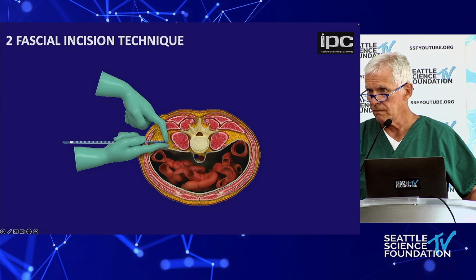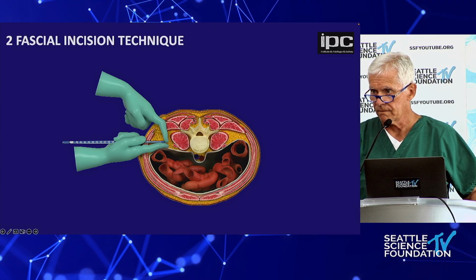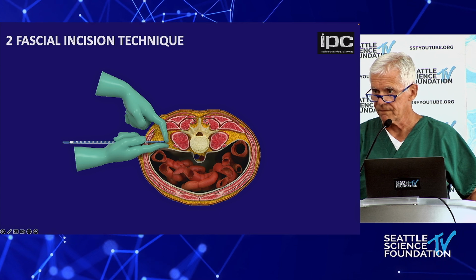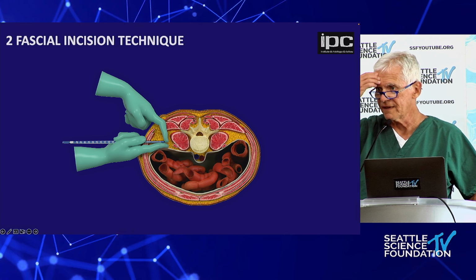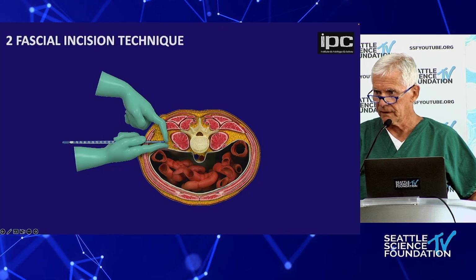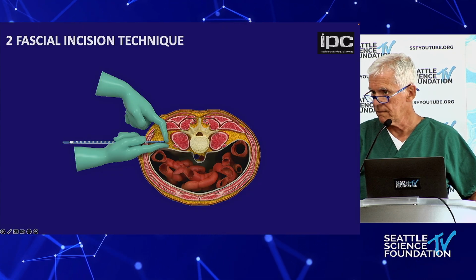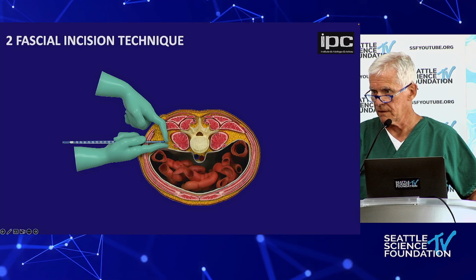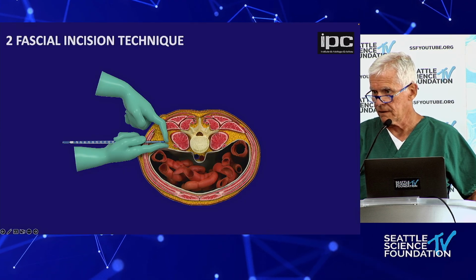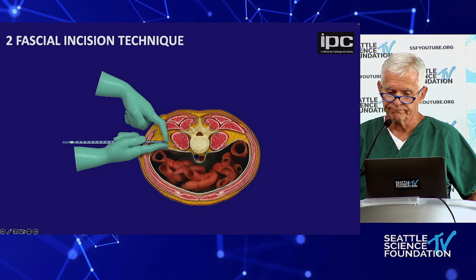You're looking at sometimes a 180 millimeter passageway and saying, how sure are you that there's nothing in between? I have to be 100% sure. Your technique is very reassuring because the tip of that dilator is never touching anything other than your right index fingertip, your left index fingertip, or the psoas. So it's always at a known spot all the way there.